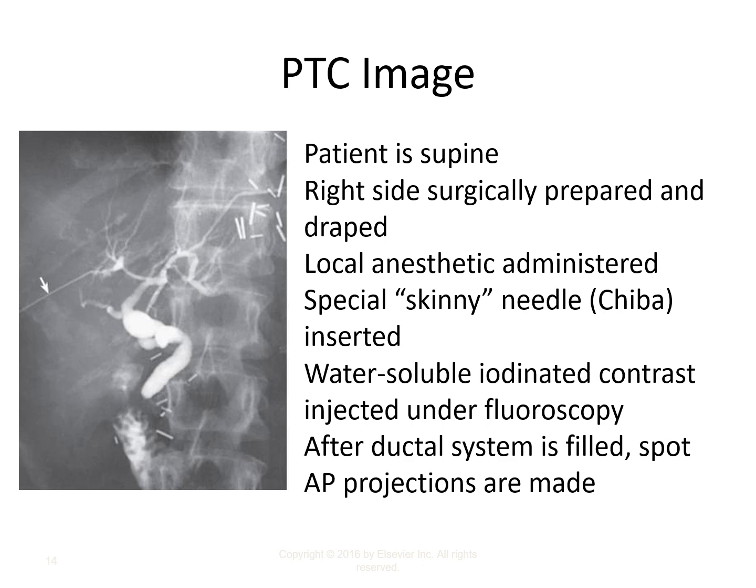So you get superimposition by the spinous structures on some of the biliary structures. Depending upon how bright your contrast is, it might make it difficult for you to see obstruction or stenosis or pathology of the biliary system with superimposition of the spinous structures.